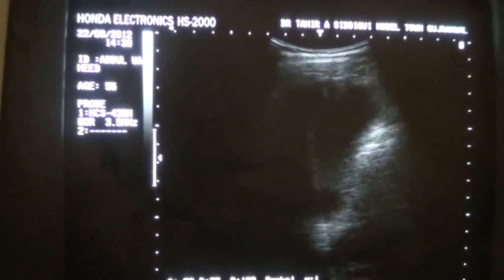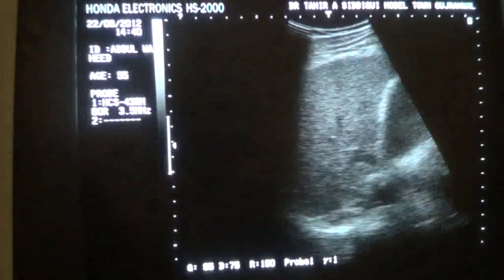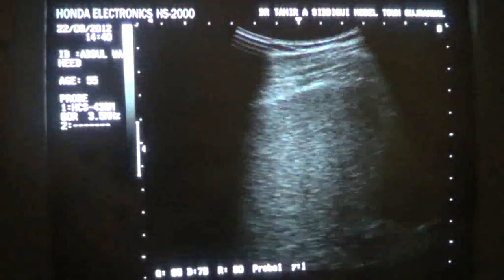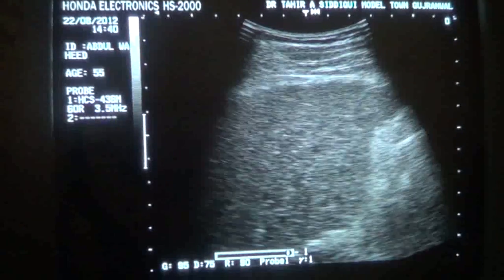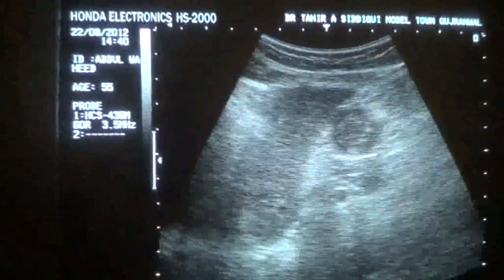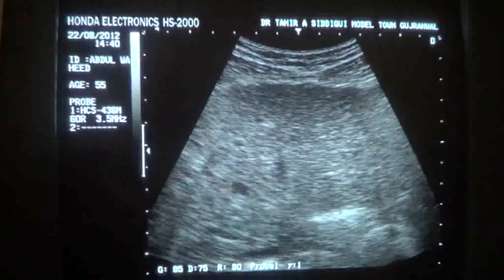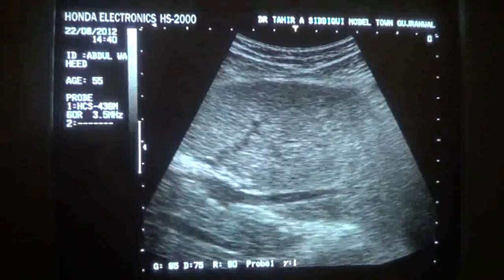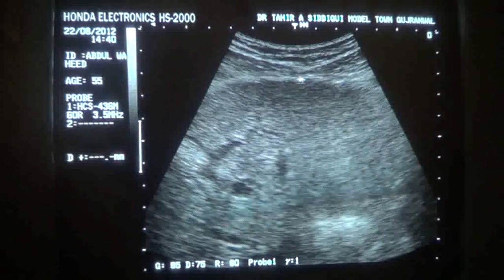Now I am going into the right intercostal space to see the outer margin. You can see that the outer margin is irregular. This is the outer margin of the liver, and again from this side — this is the transverse section of the left lobe of the liver — and here you can again see that the outer surface is not smooth.